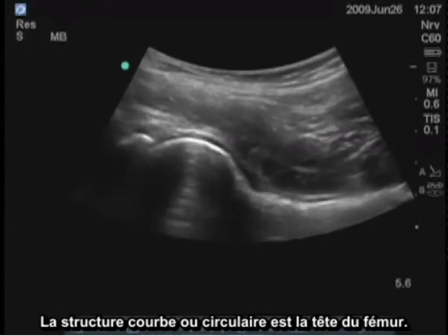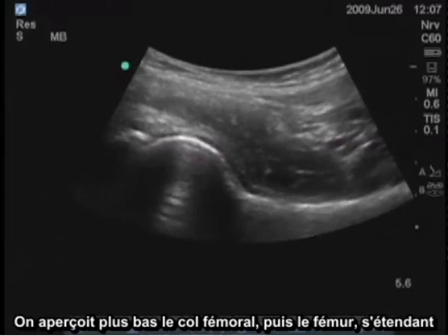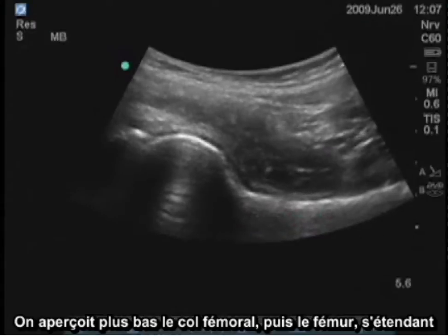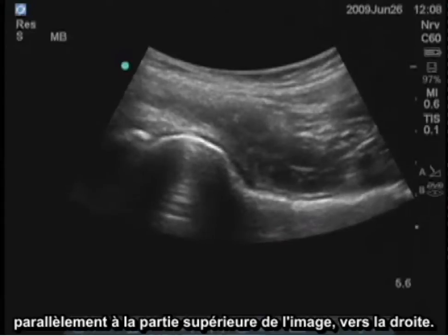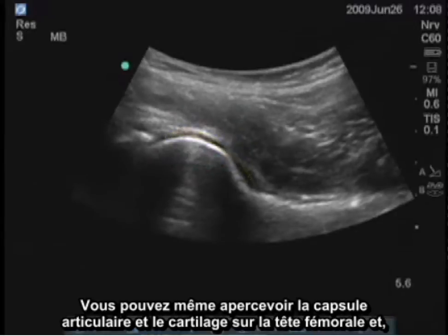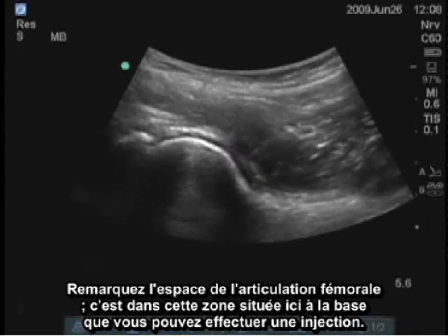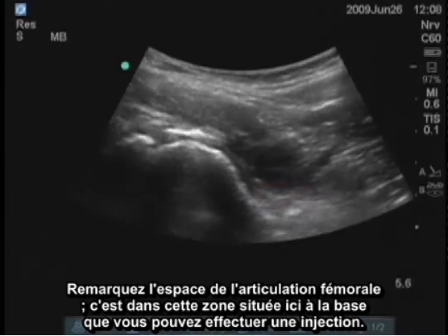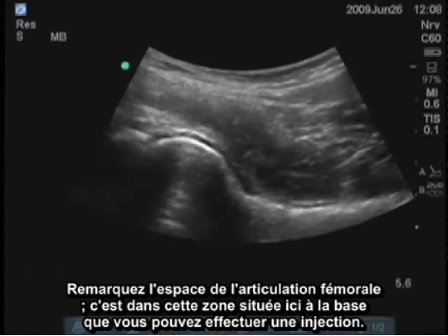The curved or circular structure is the femoral head. It then drops down to the femoral neck, and we can see the femur itself extending parallel to the top part of the image out toward the right. You can even see the joint capsule and the cartilage on the femoral head, and in the corner where the neck joins the ball of the femur, you can see the femoral joint space. That area right there at the base is where you aim when you want to do an injection.